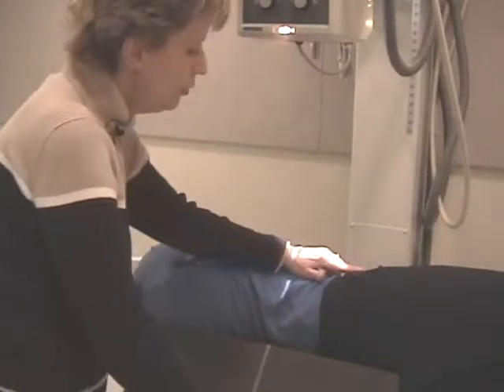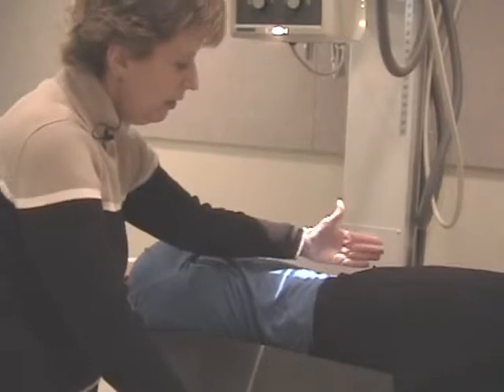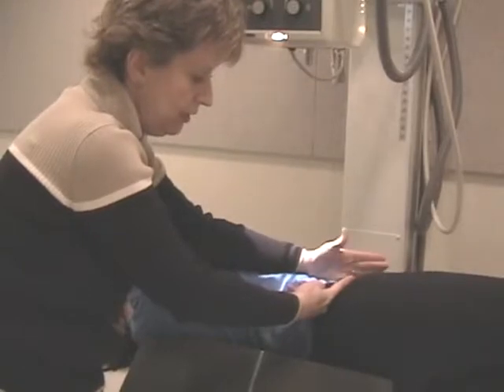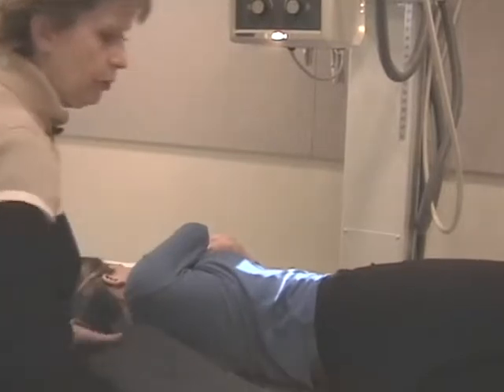I mentioned that you should be approximately 2 inches from the ASIS, the plane of the film, the central ray here. That distance should be 2 inches. I hope you can see that. There's another trick. I'm going to remove the sponge now just for teaching purposes.